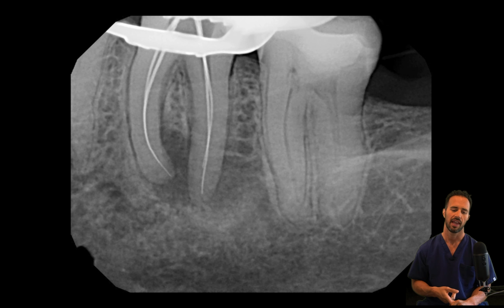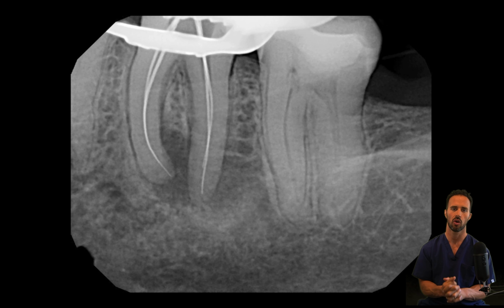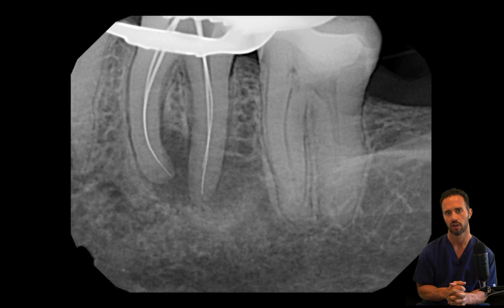We're going to keep them, and we're just going to go ahead and use a rotary file, only the last rotary file that we instrumented to. So in this case, we instrumented to size 35 in all 4 canals. So the only instrument that's out on the tray is a 35/04 rotary file.